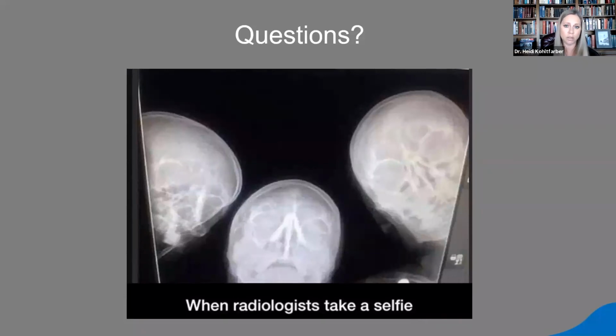Whether you do it or whether you want to send that out to a radiologist is completely up to you. It depends on your comfort level and what size field of view you have and that sort of thing. But in any case, I would document that you went through that CBCT if it's not being sent out for a formal report. That way, if someone were to come back later and ask, did you review everything?